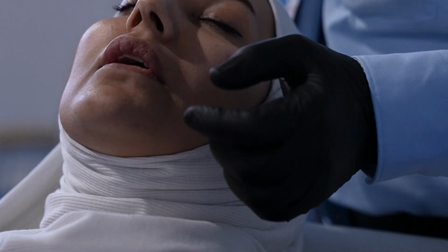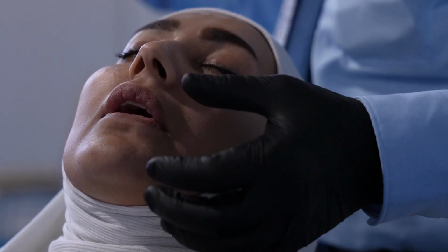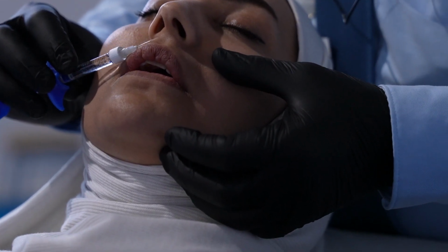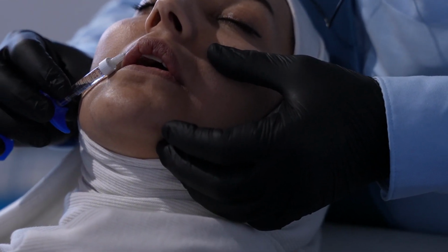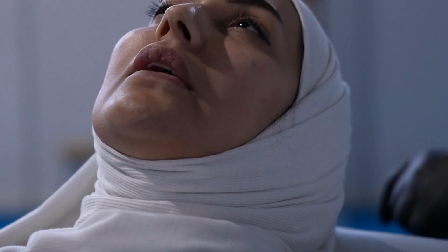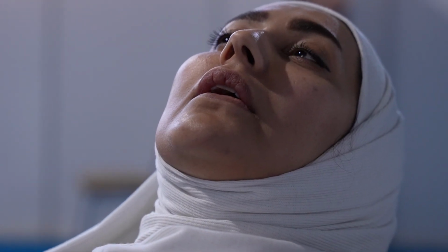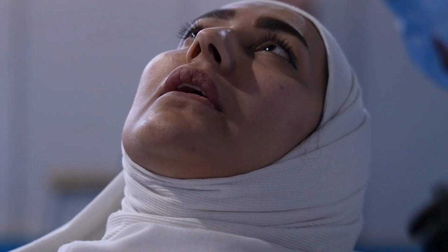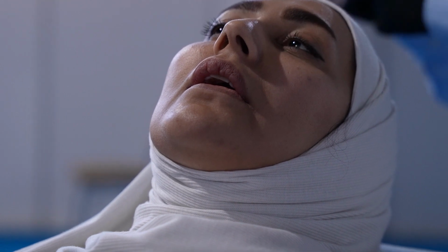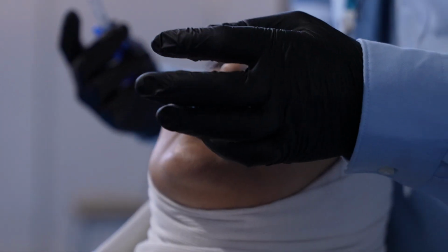Roughly we can say that to measure the scale, it will be thirds: the head of the needle, this is 1/3, and this is the other middle third, and the lips usually correspond to the 2/3 of the length of the usual filler injection needle. So start.